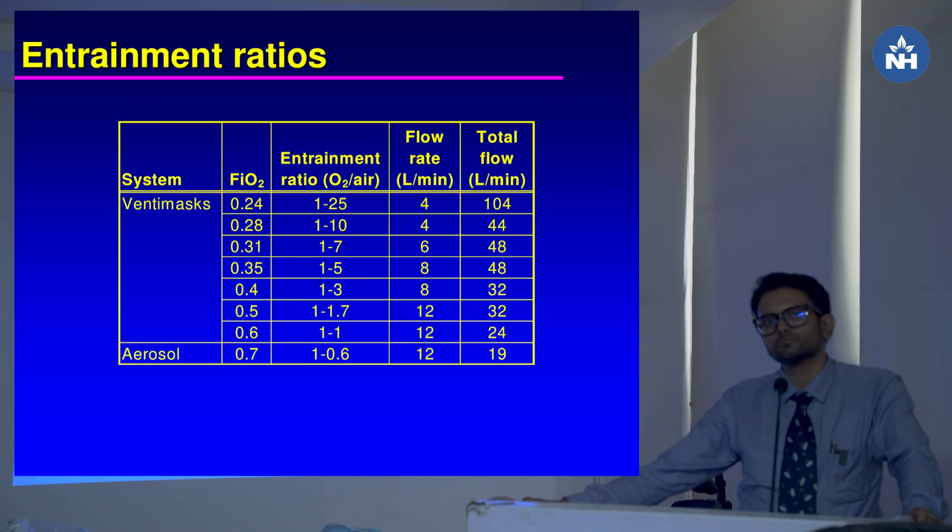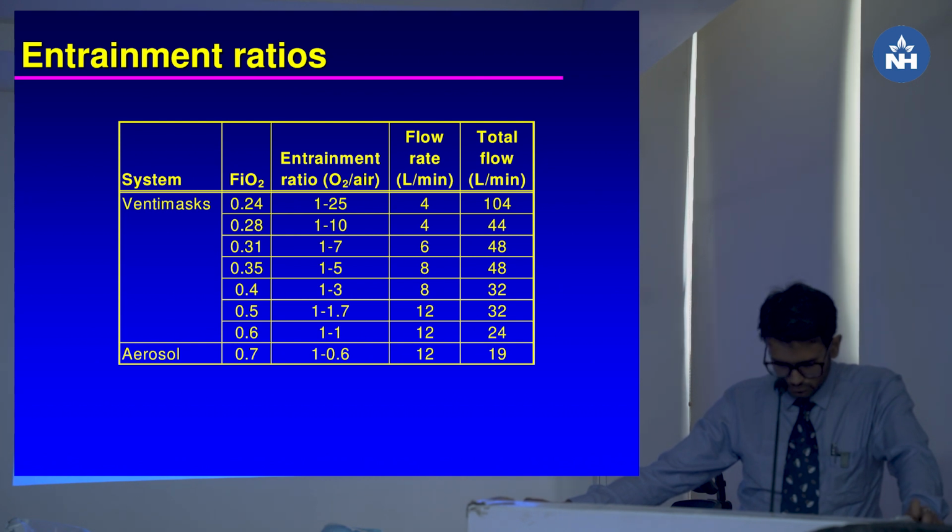So one of the advantages of a nasal cannula or a simple mask is that it is more comfortable. The patient is not claustrophobic. But the problem is that you cannot measure how much FiO2 the patient is getting.